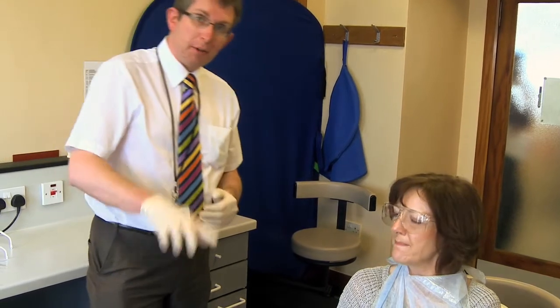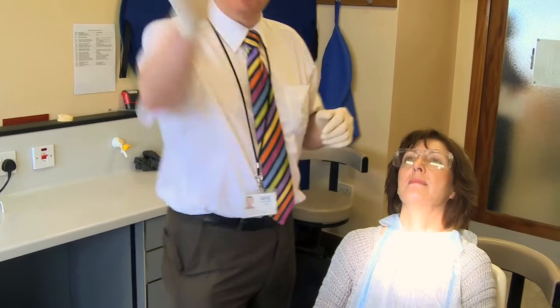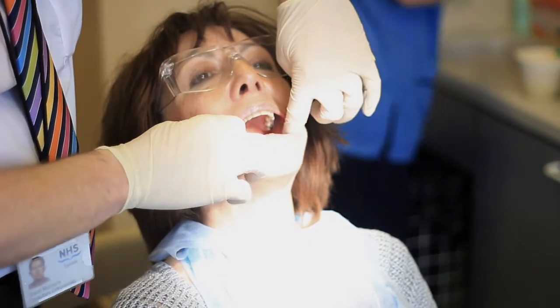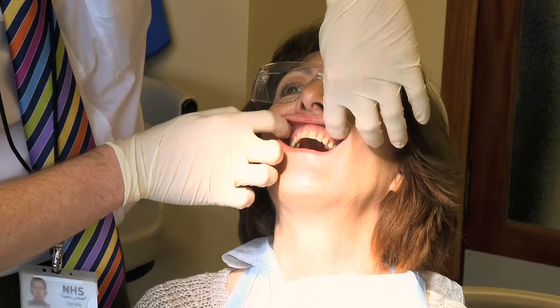Is that okay? So what I'm going to do is put this light on, and then I'll let you just stretch your head back and just adjust that slightly. So what I want to do next is to check which impression tray would fit your mouth. Is that okay? Yes. So we'll start with the smallest one.